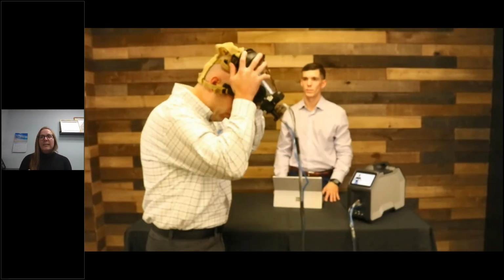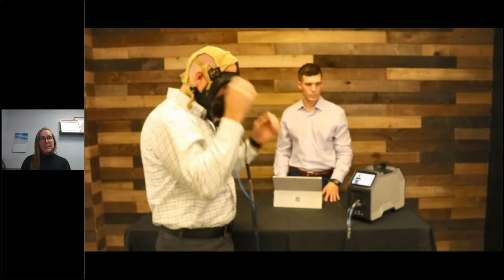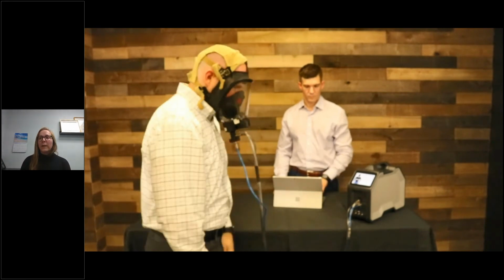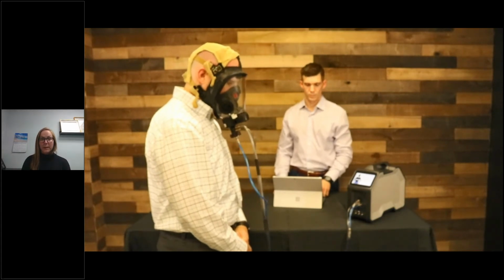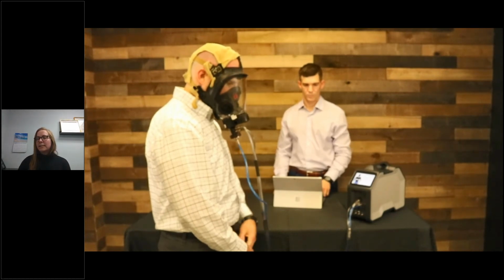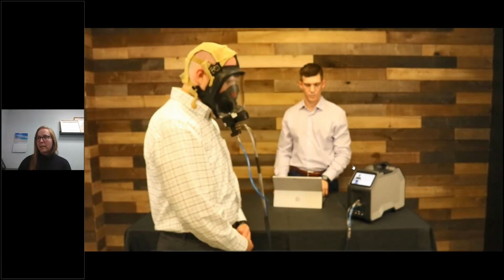So what you're going to see here is Booth just donning his respirator, just making sure he's got a good fit. But what's going to happen next is, here in the States at least, we have to wait 30 seconds. That's the test exercise. And so Booth is performing that exercise, which in this instance is just normal breathing. So he's going to breathe normally for that 30 seconds. And then what's kind of cool here is, and you can't see it well, that's why he keeps checking his watch, because we're at 30 seconds, he's going to take that breath.